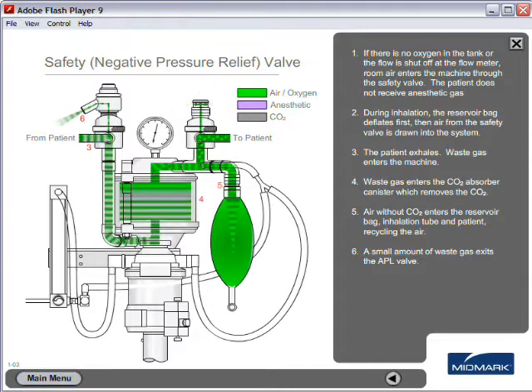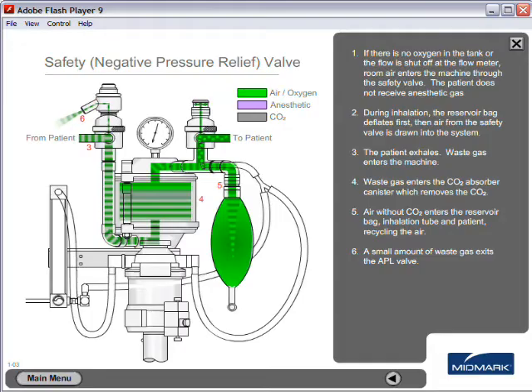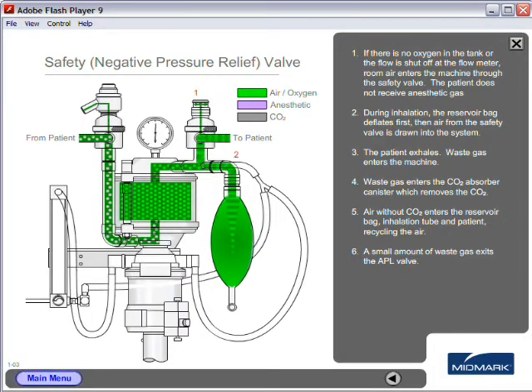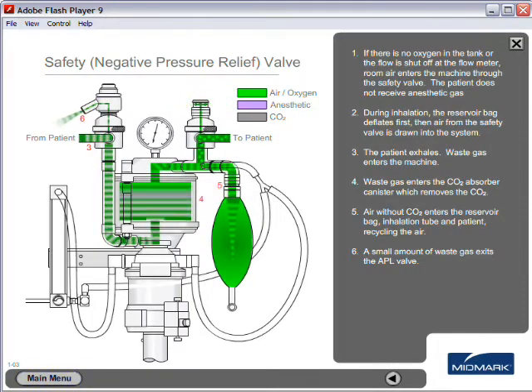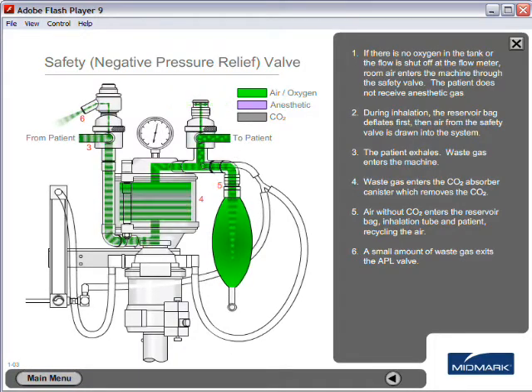Air without CO2 enters the reservoir bag and inhalation tube, recycling the air back to the patient. A small amount of waste gas exits the APL valve.